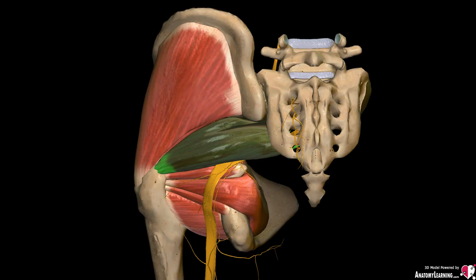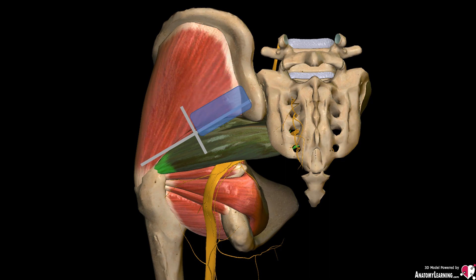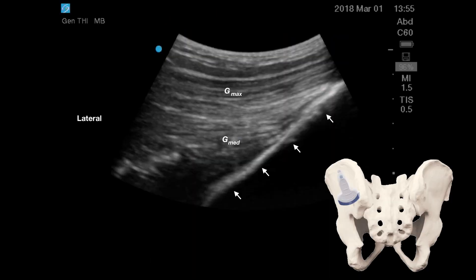In this pictorial representation, a line is drawn joining the posterior superior iliac spine and the greater trochanter. The probe is placed medial to the midpoint and moved from a superolateral to an inferomedial direction, parallel to the sacrum. When the probe is on the ileum, the continuous hyperechoic line of the ileum is seen along with the gluteus maximus and gluteus medius.